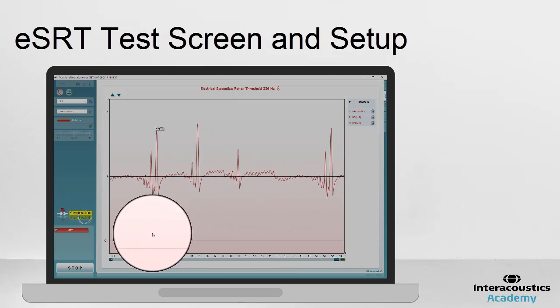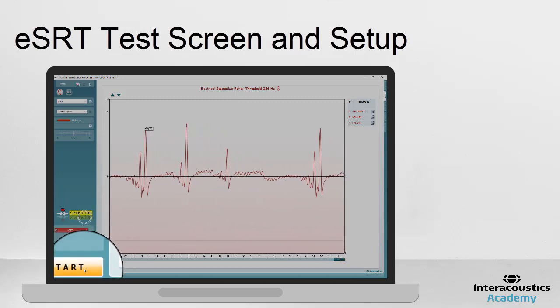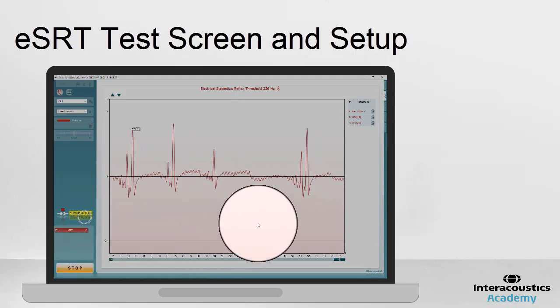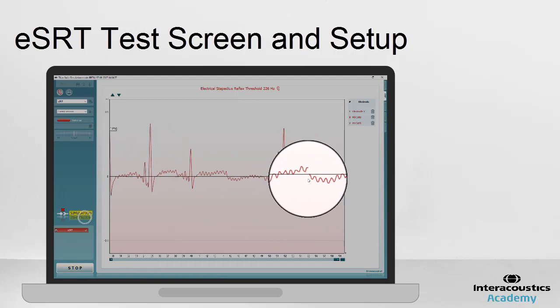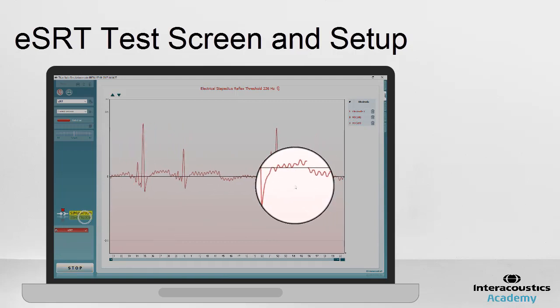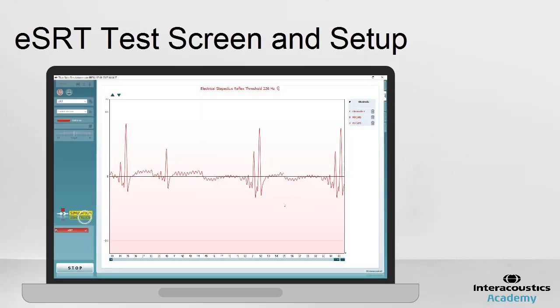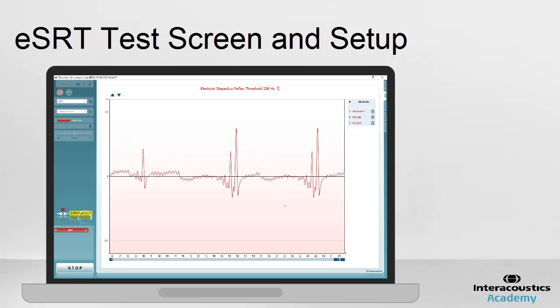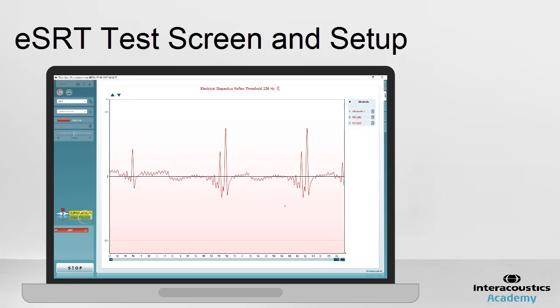The measure is stopped by pressing the stop button and at any time can be restarted. In case the curve drifts away from zero, press the stop button and start it again. Thereby, the system compensates from the drifting that sometimes happens within the first 5 to 10 seconds of the measure.